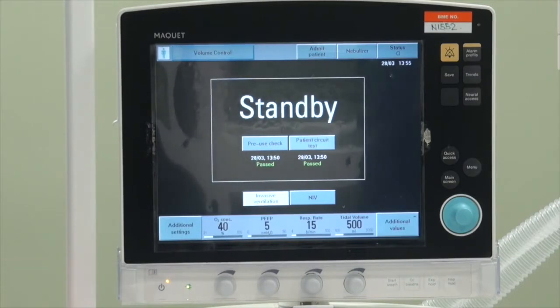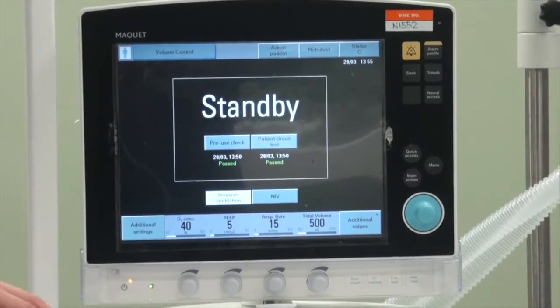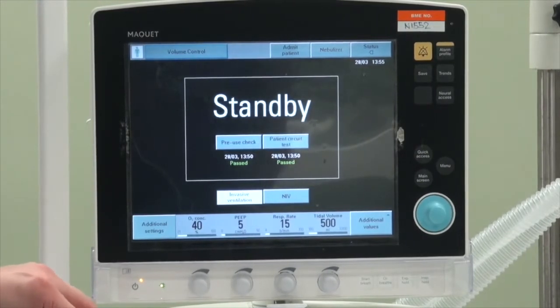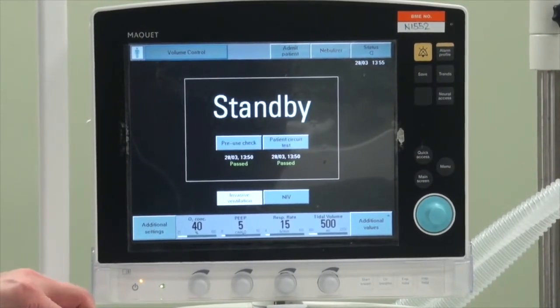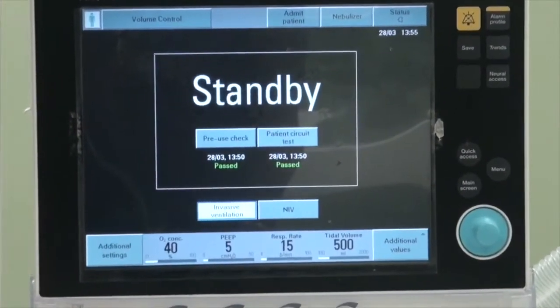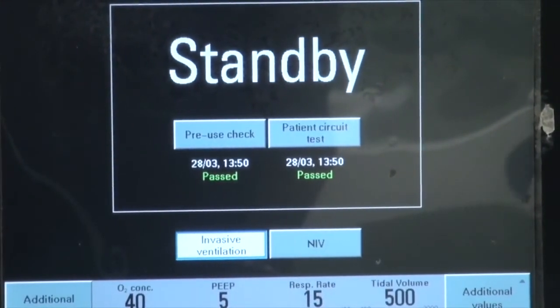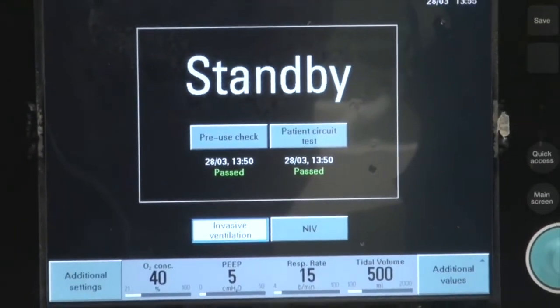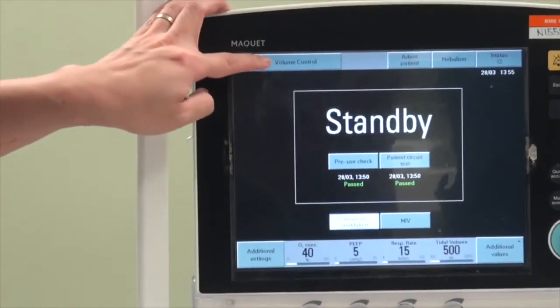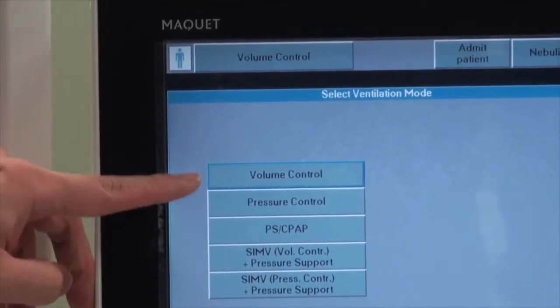We are now ready to set up the Servo-i on the mechanically ventilated patient. This is the standby screen. At the start, you have options to put the patient on invasive or non-invasive ventilation. For this scenario, we are selecting invasive ventilation. When you click on it, it turns white. You can then set the mode using the option in the top left-hand corner, which gives you the various pre-loaded modes.